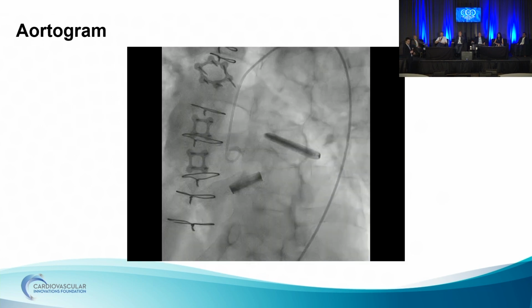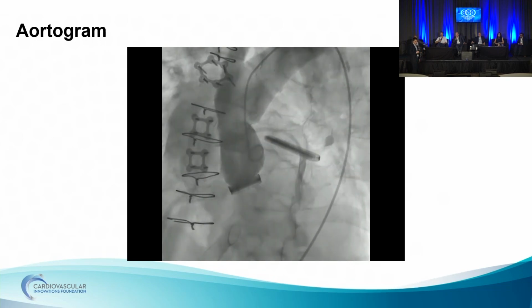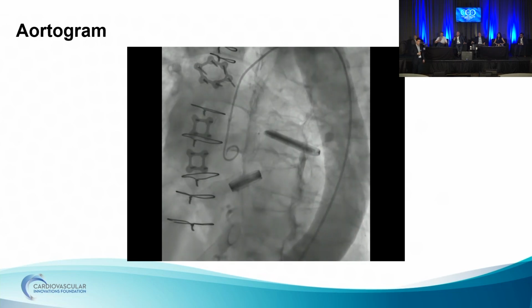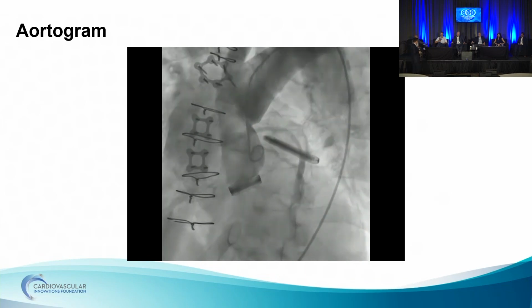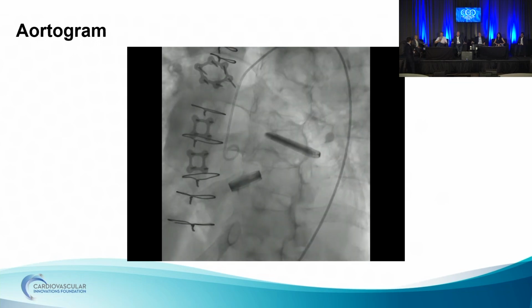Yeah, this is not an uncommon scenario with a Bentall or ascending aortic graft, you get the suture line pseudoaneurysm, either distal or proximal, and we had a fairly active vascular surgeon do a lot of this work, and there's a lot of ways to approach this, right? You can do a covered stent, but you've got the right coronary there.